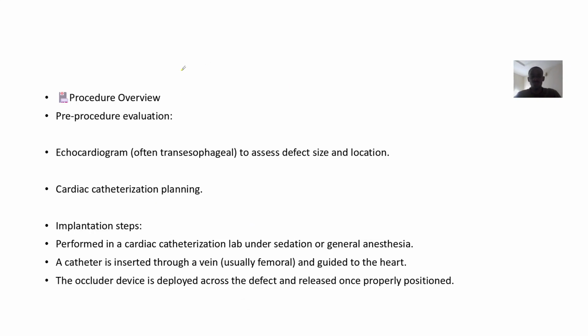The procedure is, first of all, they have to do an echocardiogram to assess the defect size and the location. Then cardiac catheterization planning.